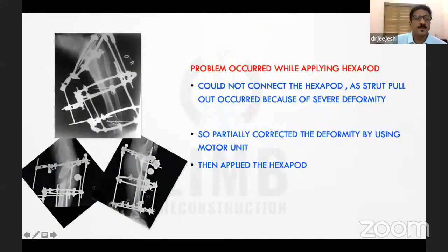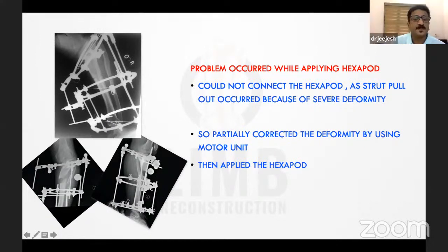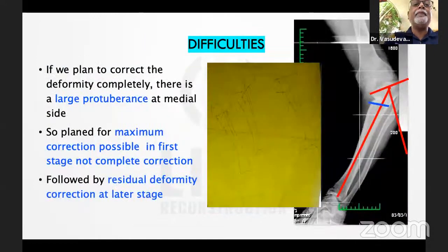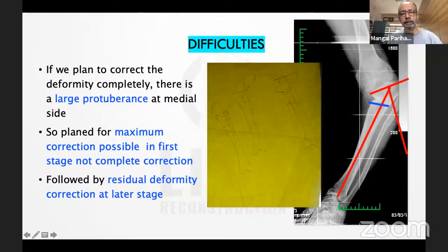Yeah. Here you can see the osteotomy was transverse. Instead of that, we tend to use an osteotomy like this. Just imagine the osteotomy is higher on the medial side and lower distally. Correct. That won't produce that much of a spike on the subcutaneous skin. Yes, this was the planning, and what he's saying is something like this, reversed in this direction, so that the medial edge is not as prominent.